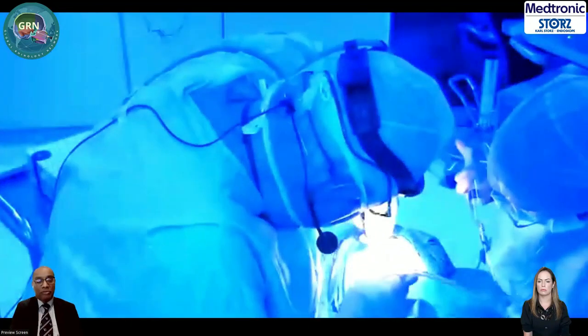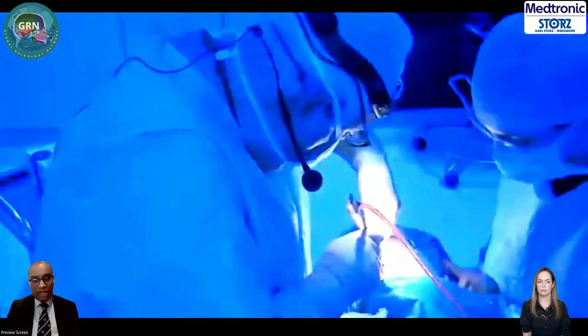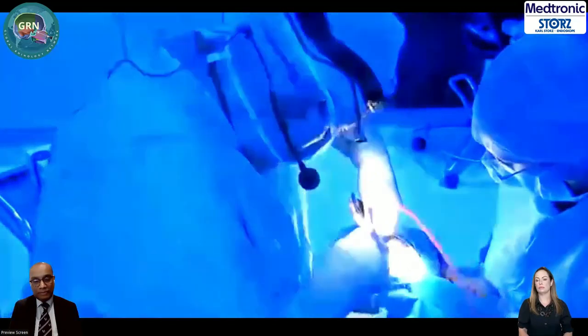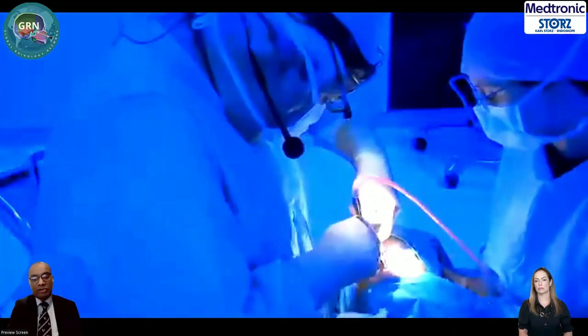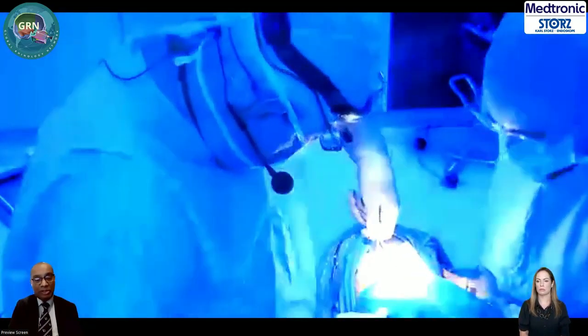We are doing the septoplasty. Okay. So if you got some time, when you will see the endoscopic view, we are starting with the endoscopic time. Okay, fine. Thank you. So we'll get back to Dr. Jankiram. Thank you.